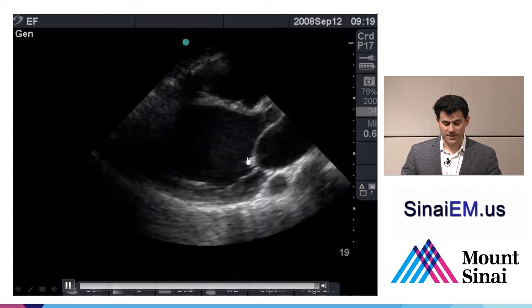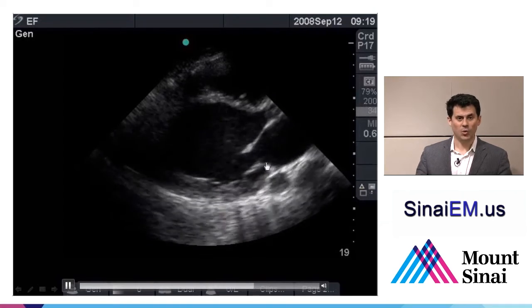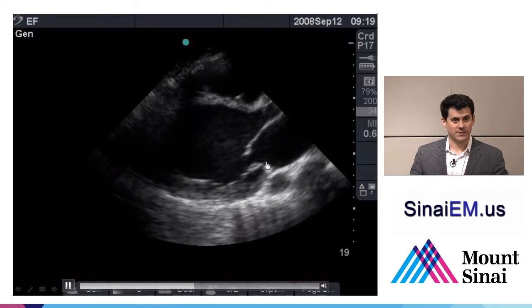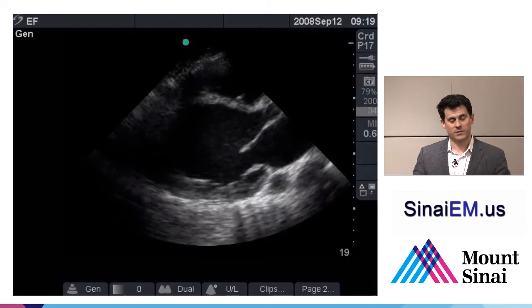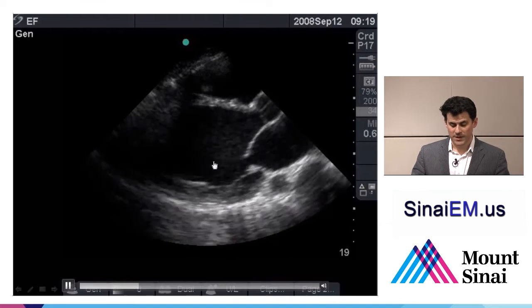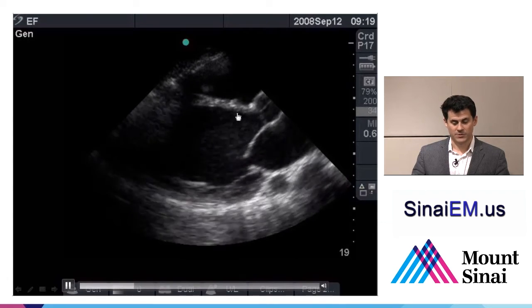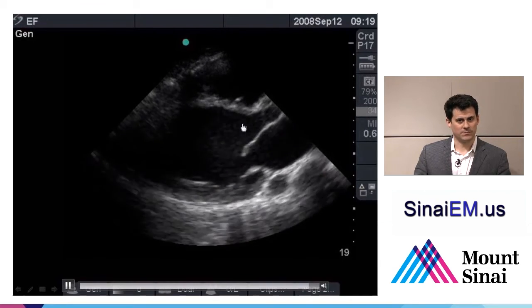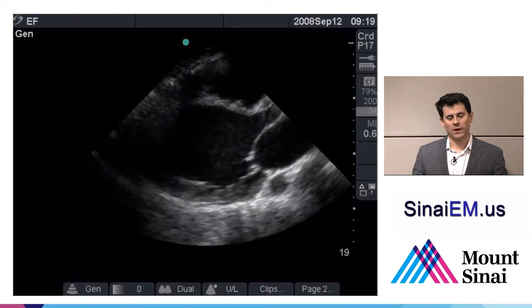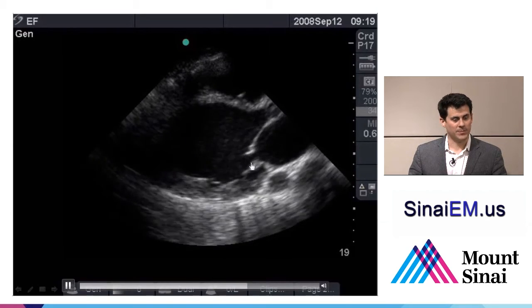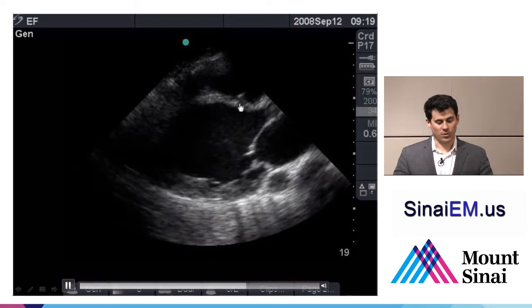Next, look at the mitral valve — the conduit between the left atrium and left ventricle. It should open fairly wide in a normal person as a large amount of blood rushes in to fill the empty ventricle during diastole. If a lot of blood rushes in, the mitral valve opens wide and the anterior leaflet should get very close to the septum. This concept is called E-point septal separation. In this case, the mitral valve is opening just a little bit, not getting anywhere near the septum — another sign of poor contractility.